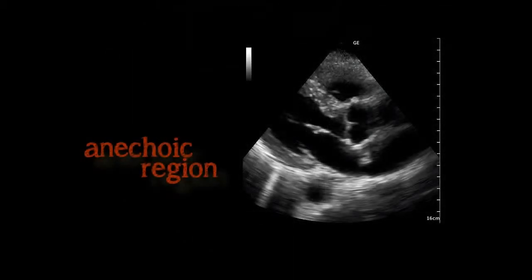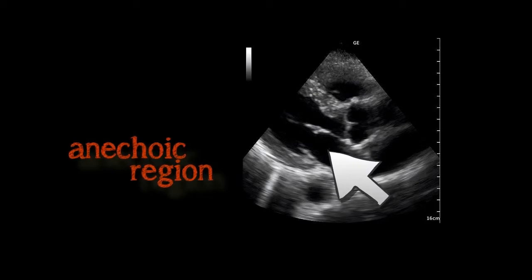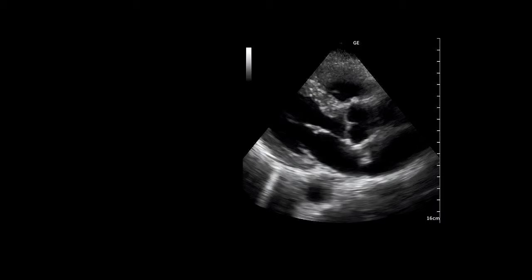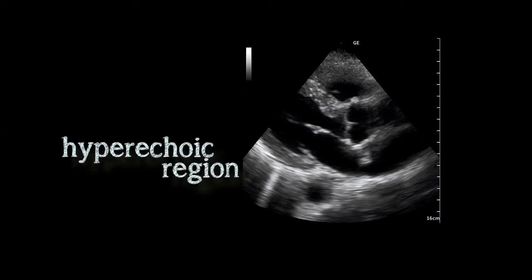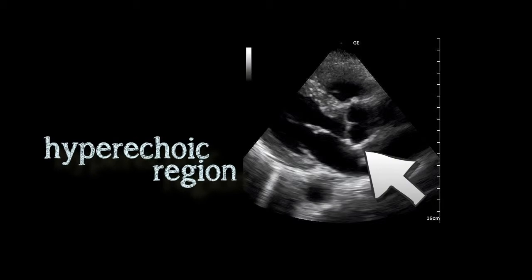Anechoic regions have no significant sound waves reflected and no image is observed, represented by the color black. These are mostly fluids inside a body cavity. Hypoechoic regions are darker gray in color, while hyperechoic regions are brighter gray in color. These different shades of gray usually represent parenchyma.